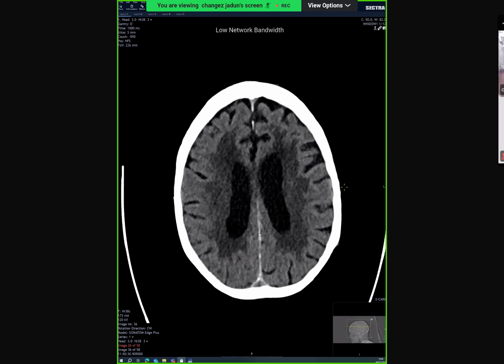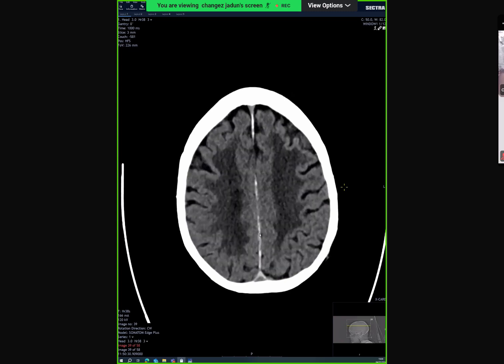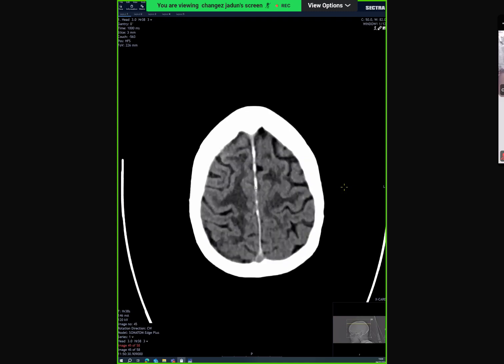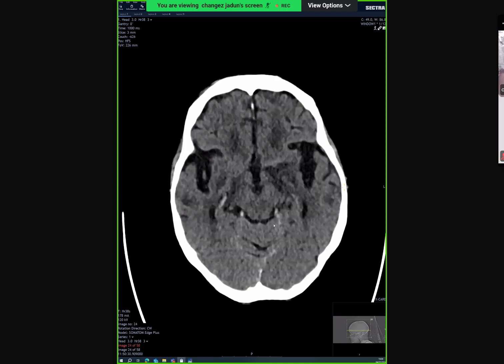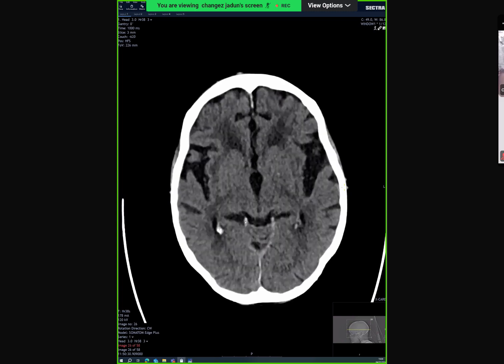The other thing which I want to mention is the calcification.